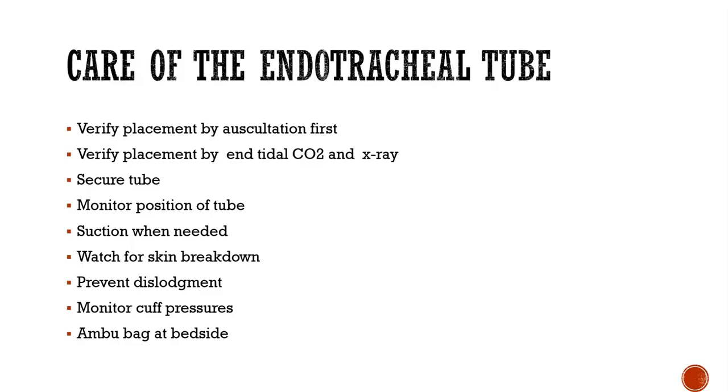In an ICU, this is going to be pretty standard. It's usually in a bag hanging on the vent or on the wall. But if your patient plugs off or they start to code, you've got to take them off of that vent and start bagging them because we can't leave them on the vent. Ambu bags are great for trying to bust up a plug, and respiratory is usually the one who does this.